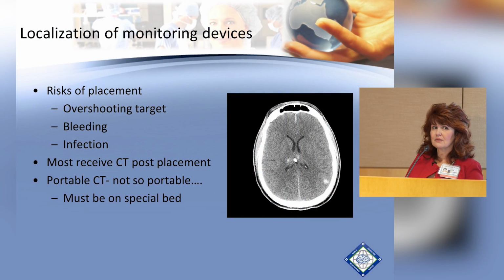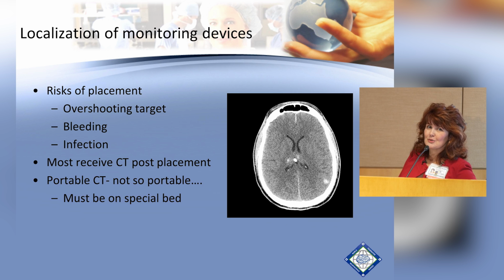I think CT scan's a wonderful tool if you have any worry at all after placement about being able to use it. Most people do receive CT post-placement, and portable for us, I don't know, it's not that portable. It's kind of hard to get them organized and get them to come and use the portable CT scanner. And they have to be on a special bed at our institution. I don't know, from a show of hands, who's using portable CT? Not many? Yeah, few. Okay.